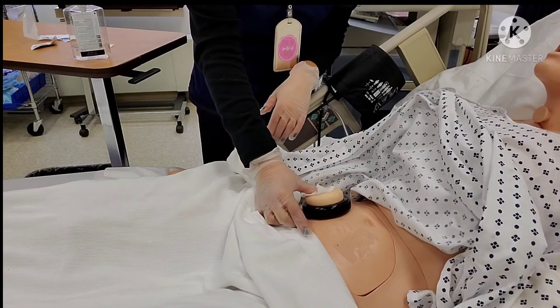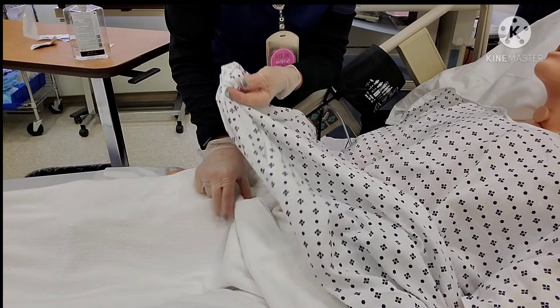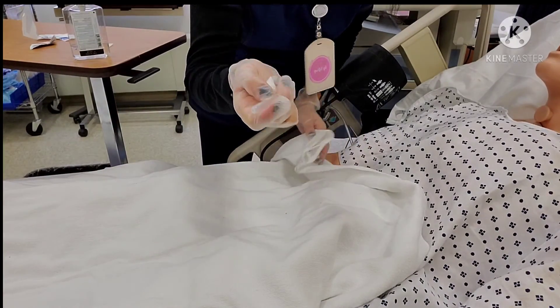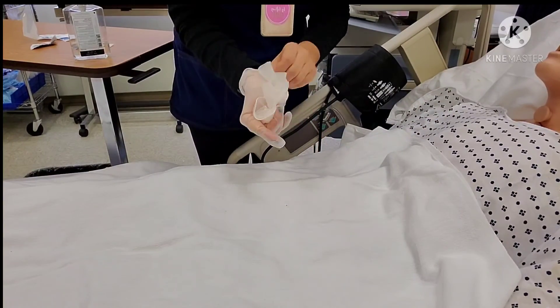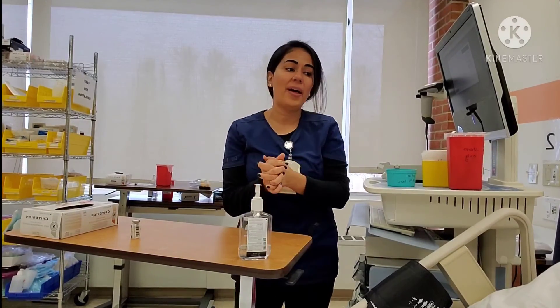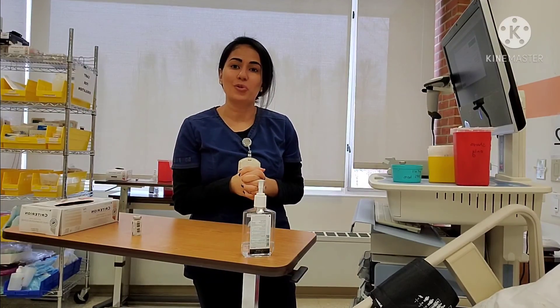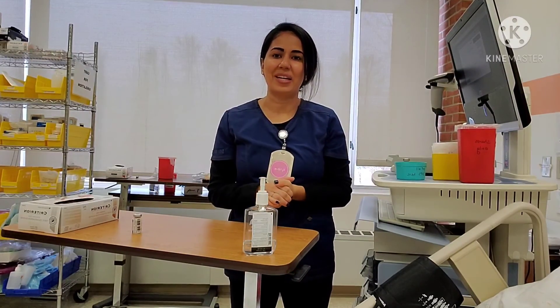How was that? That wasn't too bad, right? There's no bleeding or anything noted. I'm going to bring the gown down, make sure I'm not leaving any caps behind in the bed. I have everything I need — make my patient comfortable, remove my gloves, get rid of all my garbage, perform hand hygiene, and give my patient the call bell and come back to reassess them. So that's how you administer a subcutaneous injection — I showed you two different sites we commonly use. Hopefully that makes things a little bit clearer. If you have any questions or comments, go ahead and put them in the comment box. Bye.